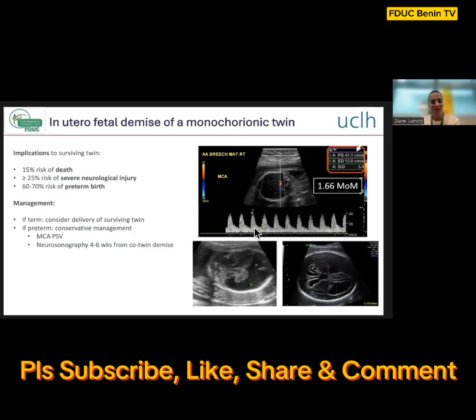There are other features that you can look for. Of course, you can look for ventriculomegaly as an indicator of intracranial hemorrhage or other cerebral abnormalities. And porencephaly, this is a picture to the left at the bottom with the green stars, where you can see this huge degradation in the white matter of the brain.